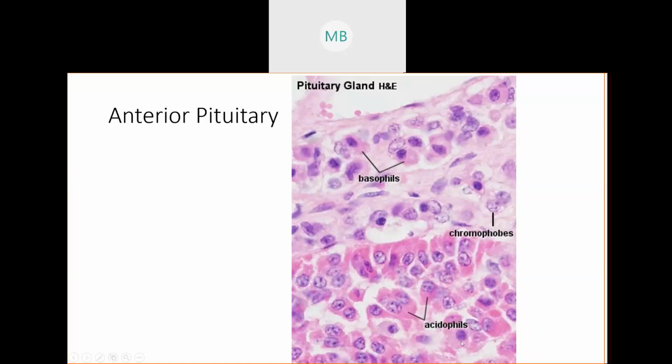and acidophils. In Latin, if you see something that ends with phile or phil, it means you have an affinity for that, or you enjoy it a great deal, you love it. So a bibliophile is the word that describes someone who loves books. These cells are called acidophils, meaning these cells have a strong affinity for acids. Because of that, they end up with a darker color when dyed. They end up being this richer, darker pink that gives the anterior pituitary its color.